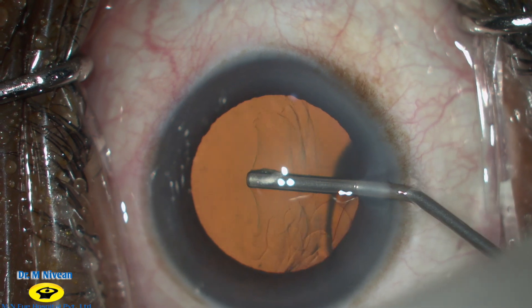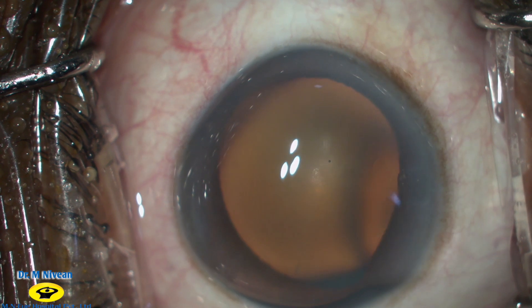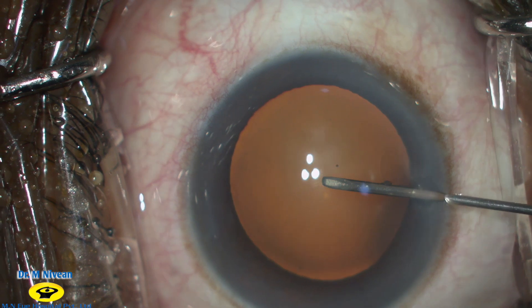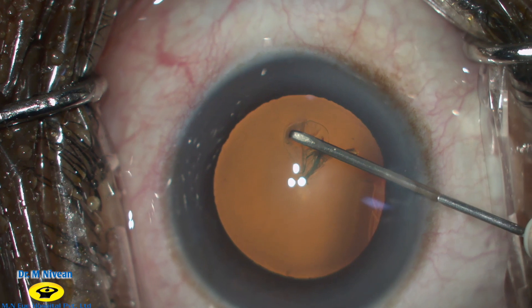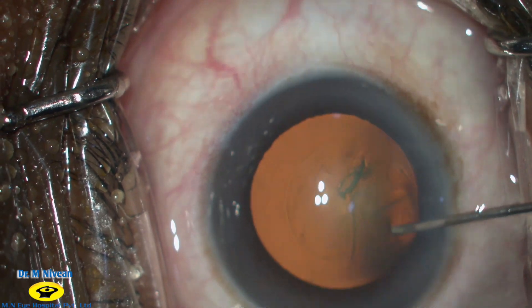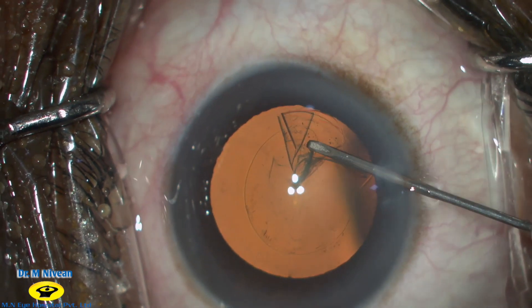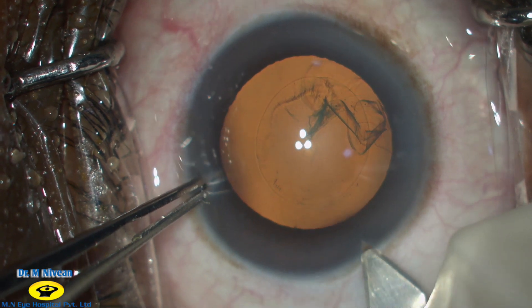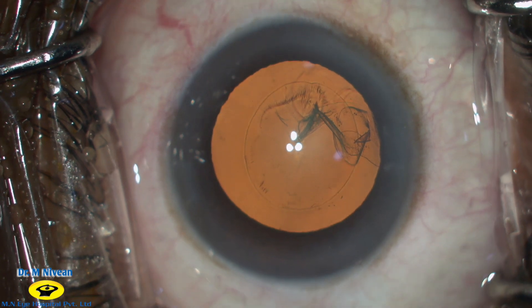A side port entry is made and viscoelastic is used to form the anterior chamber. A bent cystitome needle is used to create a 5 mm capsular rhexis, which is the adequate size for a routine phacoemulsification. A 2.8 mm keratome is then used to create a biplanar entry into the anterior chamber.